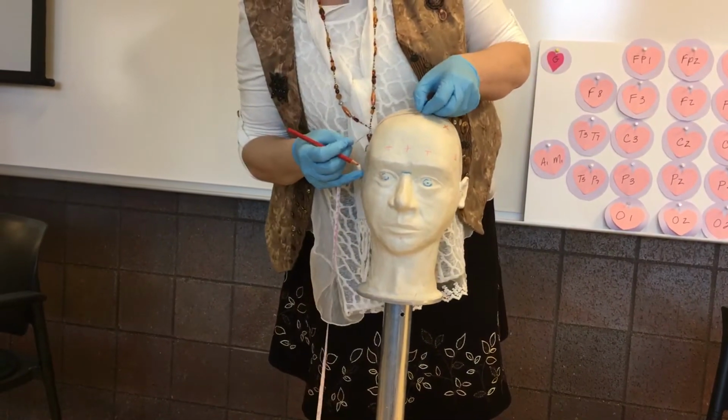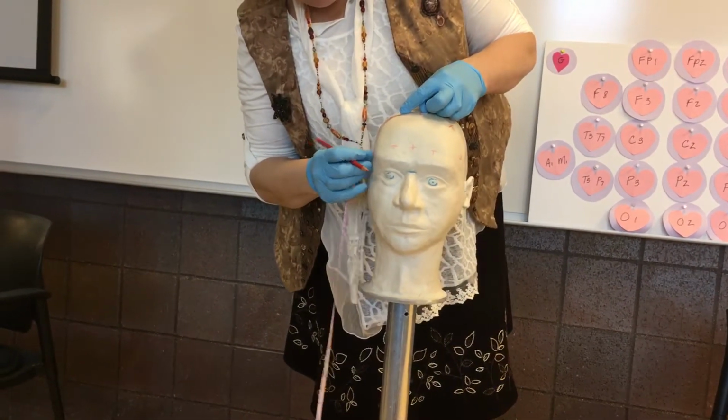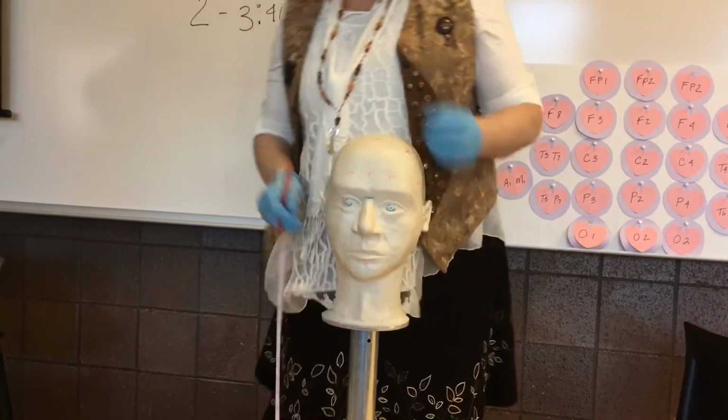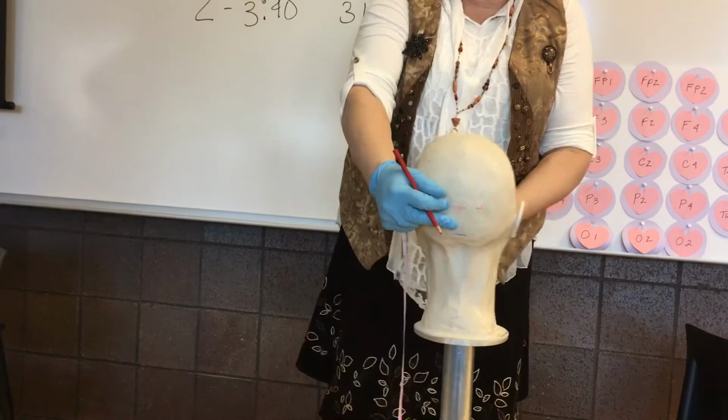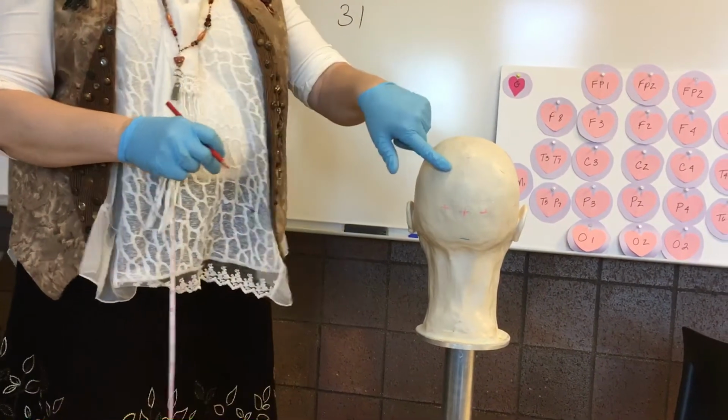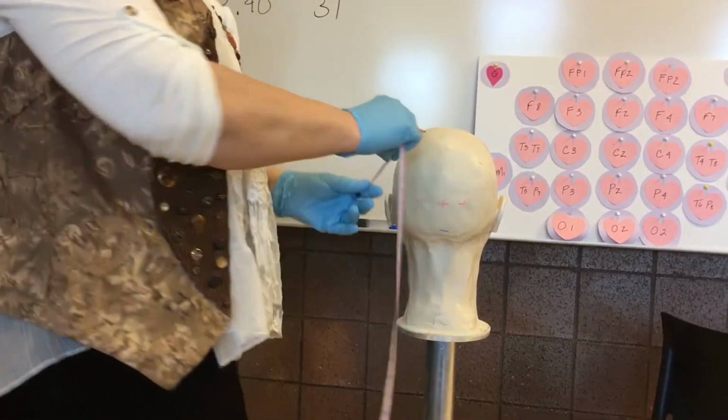Oh, I didn't cross this one. 5.75. Do you see those measurements? One more set of measurements in the back. Anterior horseshoe, posterior horseshoe. Okay?